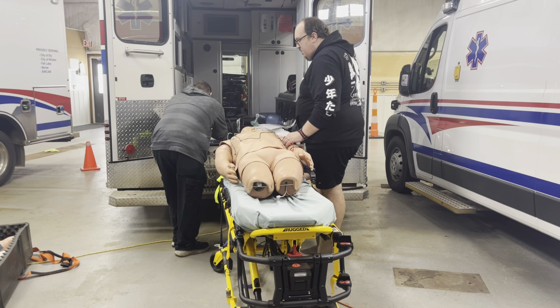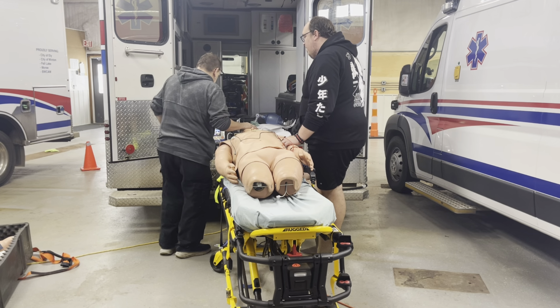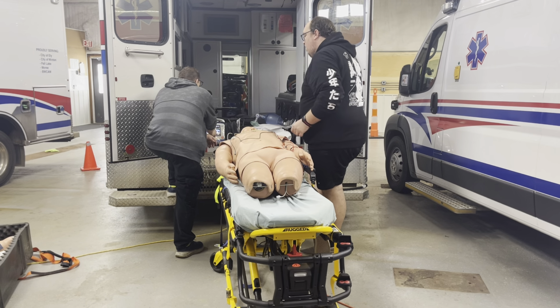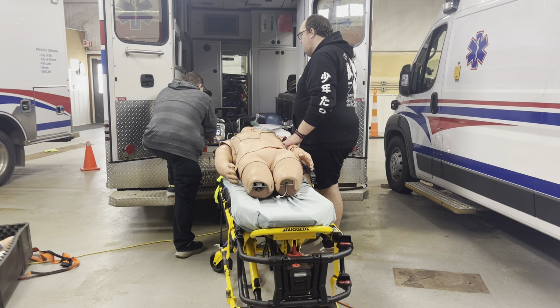And of course, with this kind of patient, what would you do to him since he's still awake? Tell him you'll feel something. Well, you can sedate him a little bit. He's gonna feel mild because we're only giving him low dose on here. So once you get into there, you just keep increasing it until your waves start connecting here. And they will. Perfect. Yep. And you want to go that 10 over like you did.